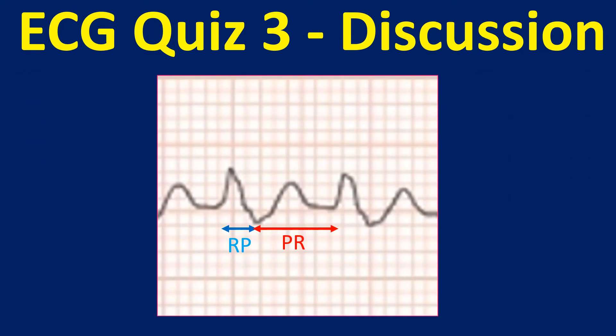This pattern can be seen in atrioventricular nodal reentrant tachycardia, or AVNRT. Here the RP is shorter than PR — from the retrograde P to the next R wave — qualifying for the short RP tachycardia of the slow-fast variety of AVNRT.